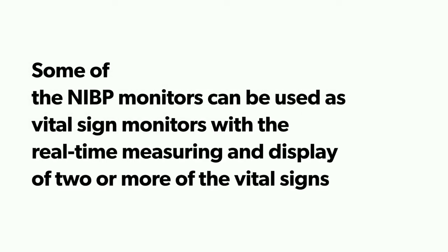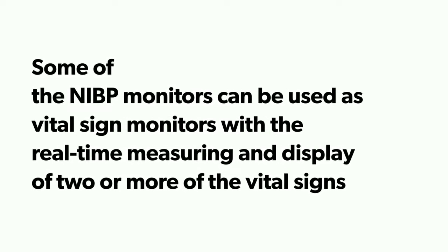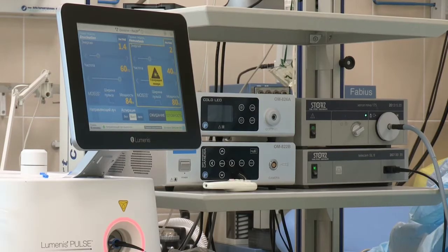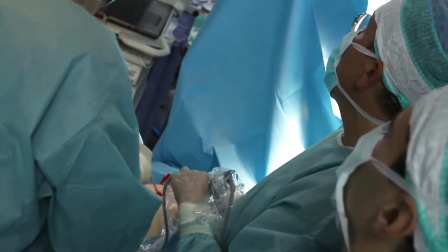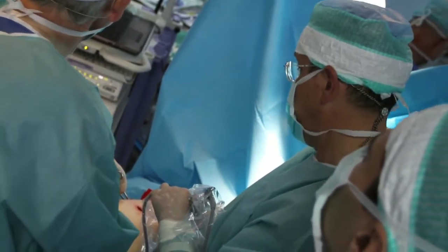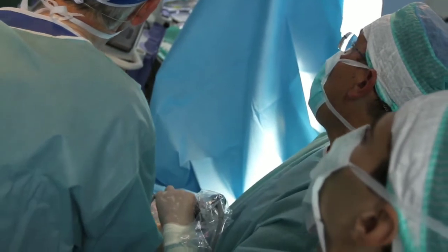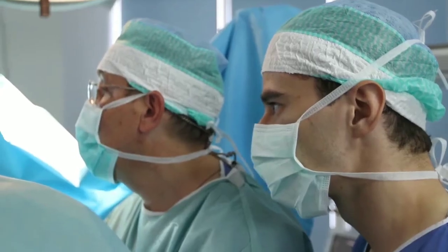Some of the NIBP monitors can be used as a vital sign monitor with a real-time measuring display of two or more vital signs. These monitors typically consist of portable or mobile electronic units. This monitor may be connected to a line or powered by internal batteries. Many devices may also perform continuous monitoring during transportation or even at the bedside. The vital signs physiologic monitors are intended mainly for periodic automated measuring of the parameters of one or more patients.